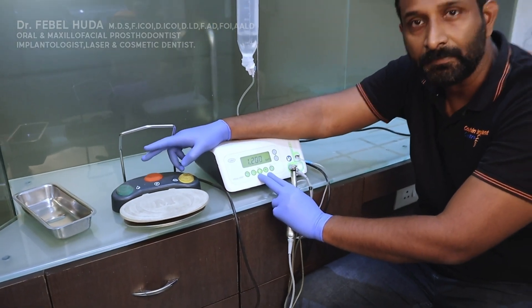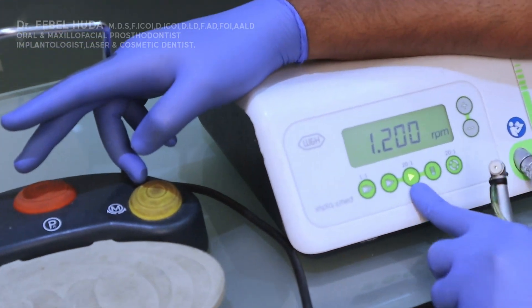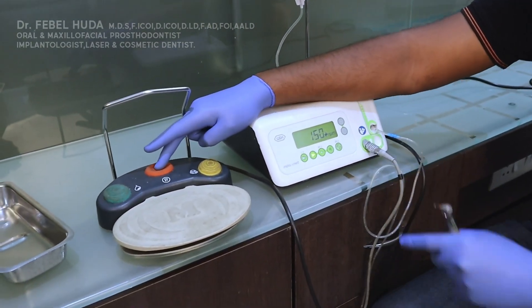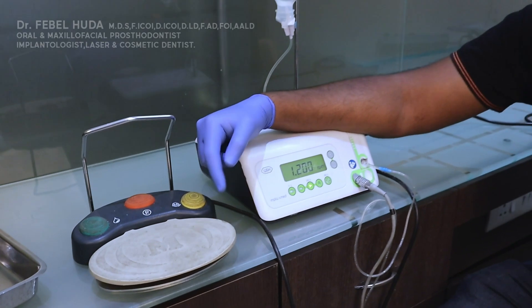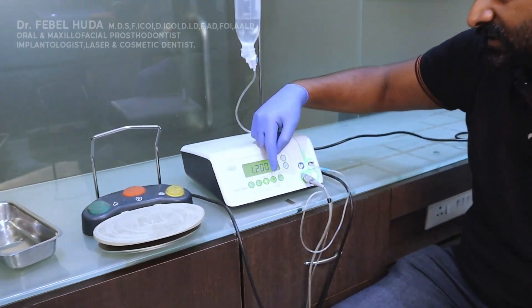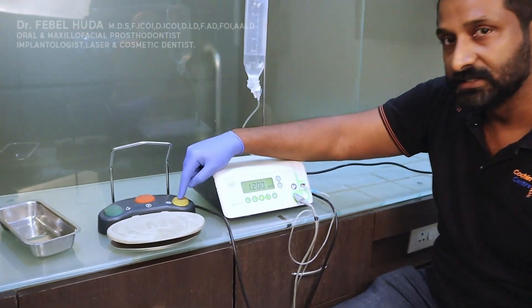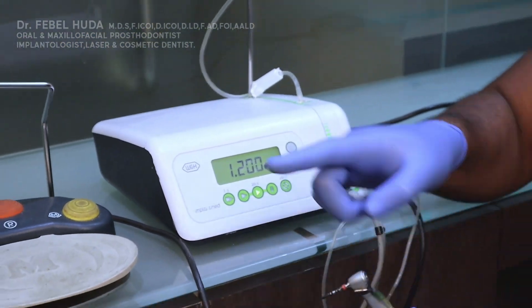In the implant program there are two modes: one for drilling your osteotomy into bone, and one for placing the implant into bone. There's also a forward/reverse switch — when it burns constantly, your handpiece is in forward mode drilling into bone. When it blinks, it's in reverse mode, rotating in the opposite direction.